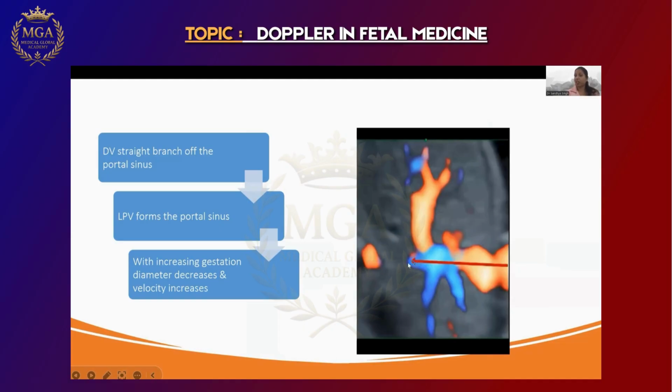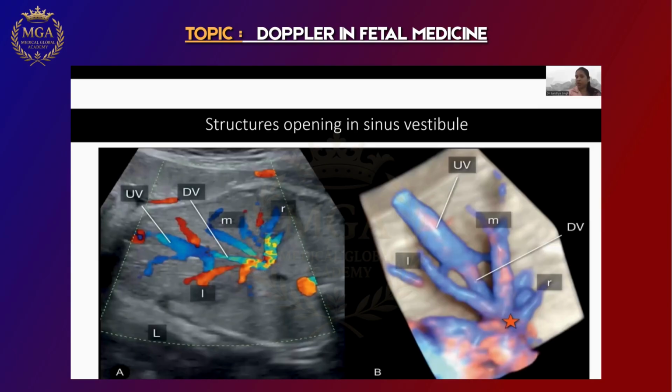And this will go straight through the foramen ovale to the left side and to the brain. We know there is no mixing of the blood in the baby. Through the foramen ovale, the oxygenated blood will directly reach the brain. It will be supplied. So that is why the ductus is very important. And I need you to remember this image, very important.